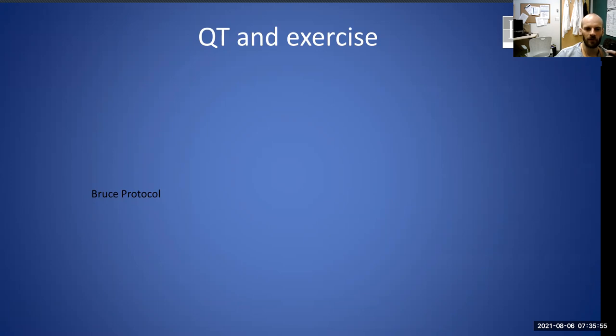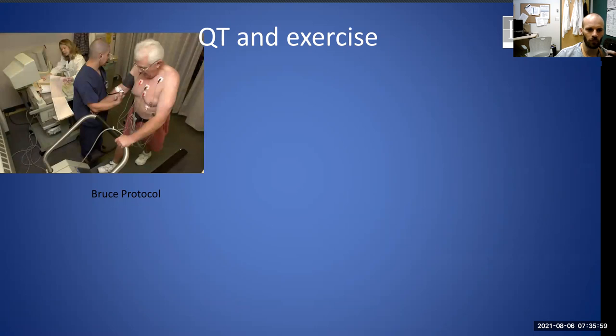So when we're looking at QT and exercise, what we often do is put people on a treadmill. The standardized exercise protocol that we use is something called the Bruce protocol, named after Dr. Bruce, an eminent cardiologist from way back when.